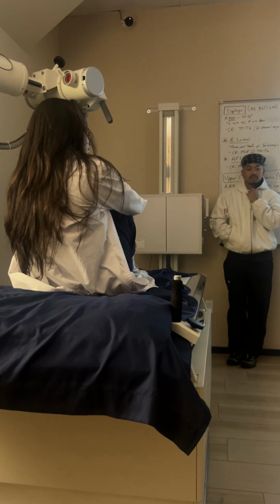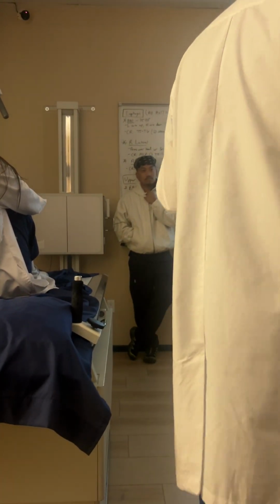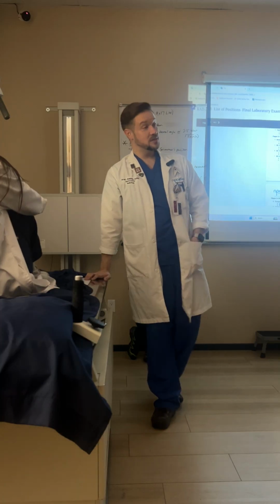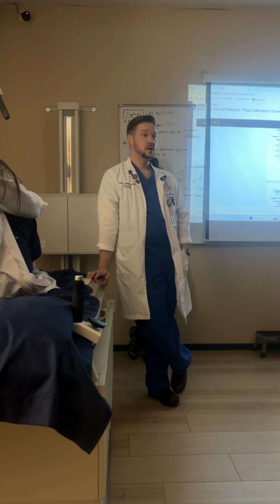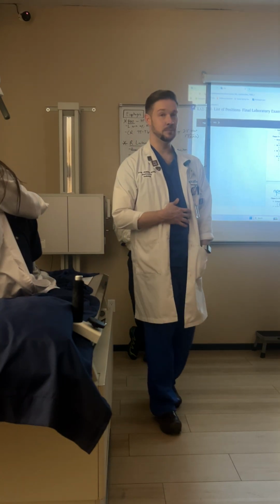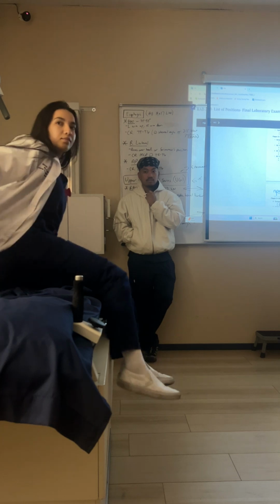I'm going to be here to help you the entire time. Once the radiologist is done with his images, we're going to drop the bag, let that barium flow out, and then I'm going to take one more image. Probably the worst explanation possible. But during the procedure, you're going to be feeling a lot of pressure in your bowel, in your stomach. I just want you to try to breathe through that, breathe through your mouth so that you can keep everything nice and relaxed and prevent cramping in your stomach, okay? I will see if I can find something that's more succinct than what I just said. It's been a while since I've explained a BE, but I will give you guys a good tool.